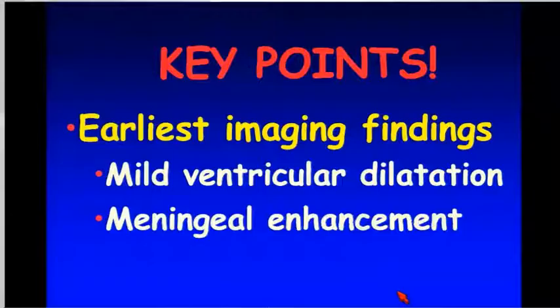Now, I'm going to go back to that slide because I think there's a key point here for sure, and that is that one of the things we need to remember in reading emergency cases is on that non-contrast CT in a patient with mental status change. Even the slightest rounding of those ventricles, third ventricle, the temporal tips, you have to think infection. That's something that can kill someone if you don't suggest this could be a meningitis, an early communicating hydrocephalus.